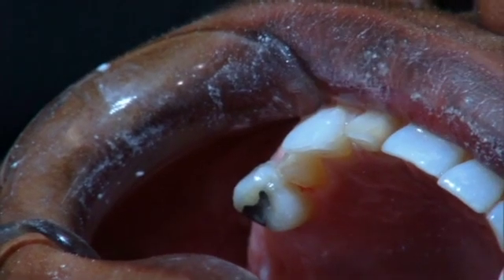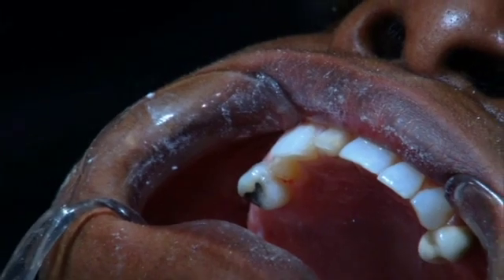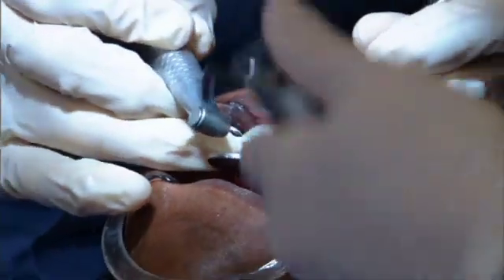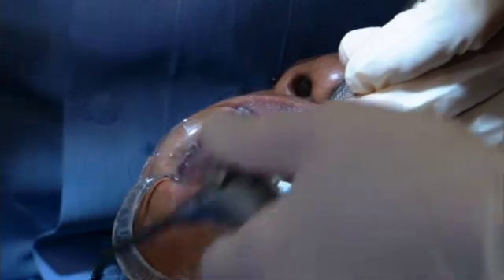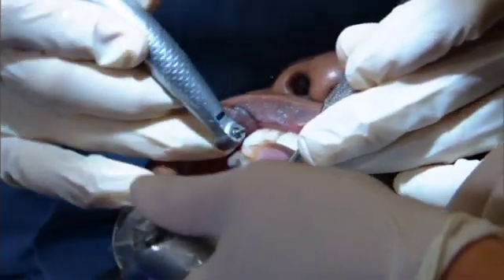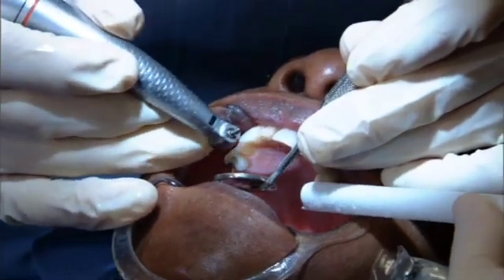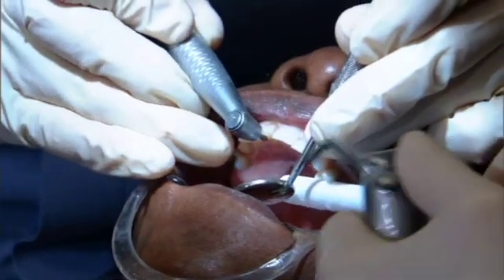Now I'll switch out my burrs and I'll switch to a 3mm diameter football diamond. Ideally, we'd like to have 1.5 millimeters to 2 millimeters of lingual reduction. So if I use a 3mm diameter super coarse diamond, I'll use half the depth. And so I'll just sink it to the shank and get half the depth.